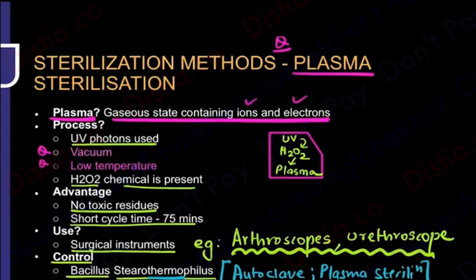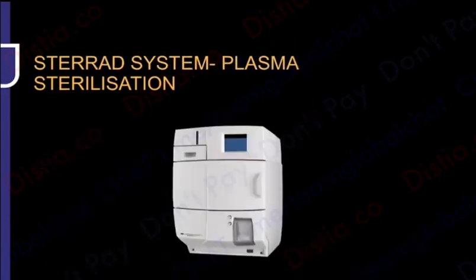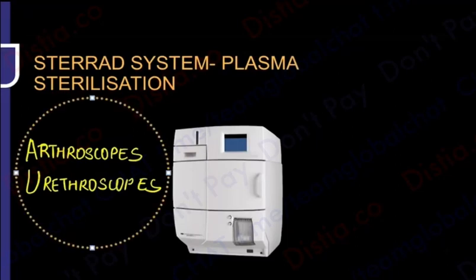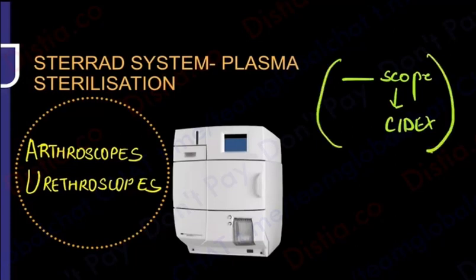Okay, but this is your basic as of now, and this is the machine. So if they give you this machine and they ask you what will you sterilize under it, I'm telling you again and again, this question will come. Arthroscopes and urethroscopes are sterilized here. All the other scope things that we were doing, those were going under Cidex. Whatever XYZ scope you were doing, bronchoscope, laryngoscope, that will go in Cidex. Are you clear with plasma sterilization? Because plasma was the 4th state of matter.